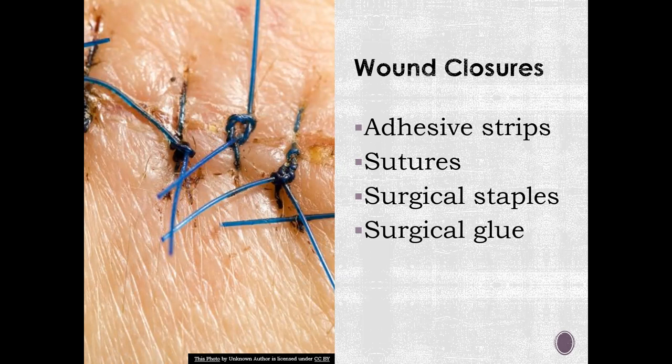And then we have surgical glue, which is safe for use in clean, low tension wounds, and it's ideal for wound closure method for skin tears.